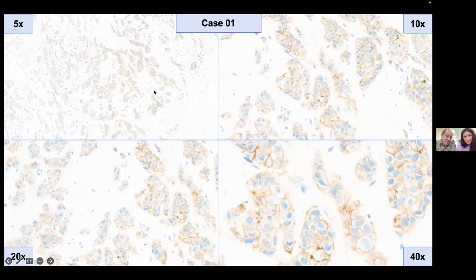Is there any staining here? I mean, there's definite staining. But now the question is, can we see membrane staining? Exactly. And to me, this is not very sharp. What we mean by can you see membrane staining is can you see it without straining yourself? Because if you strain yourself, maybe you see it. I see some blobs of staining, if I'm honest. No membrane staining. You need to be comfortable to say, look, this is clearly membrane staining.